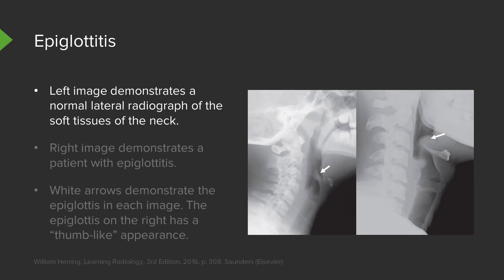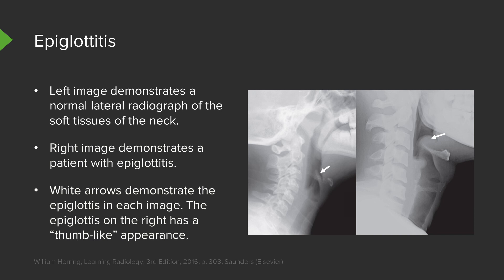This is most quickly diagnosed by a lateral radiograph of the neck. Here are two lateral images — the left image demonstrates a normal epiglottis pointed out by the arrow, and the right image is a patient with epiglottitis, also pointed out by the arrow. The epiglottis in the normal patient is a very thin structure, while in a patient with epiglottitis, it's a much thicker structure which can result in airway obstruction. In a patient with epiglottitis, the epiglottis has a thumb-like appearance.